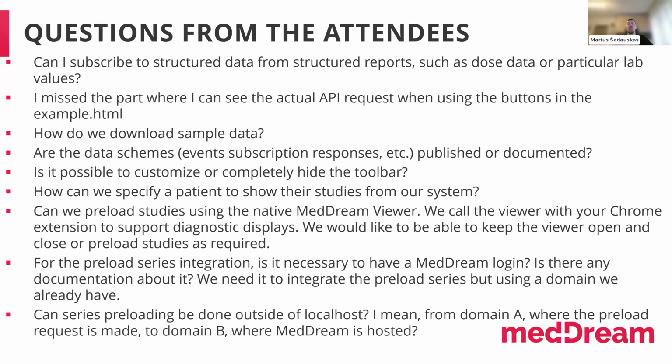No, you don't need to. If you talk about the MedDream login window, then no, you don't need it. To log into MedDream, no, because it runs through a URL integration, either the token disabled or token enabled URL integration. About these integrations, we had a webinar a few months ago, in September of 2025. So you can check our recordings on how our URL integration works, but you do not need to log in.